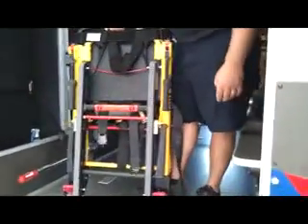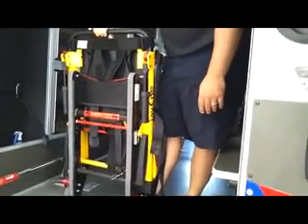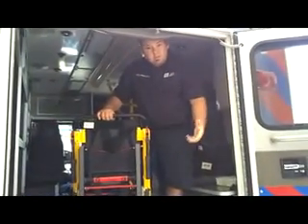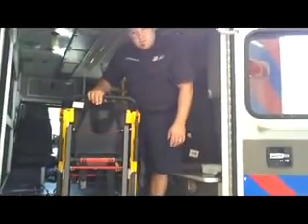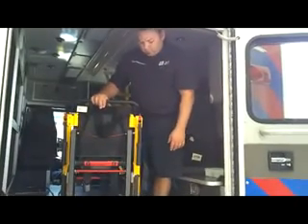This piece of equipment here is a stair chair. It basically turns into a chair if we have to take the patient downstairs. We don't have a lot of places in town with a lot of stairs, but the old school way was to grab a kitchen table chair and bring the patient down on that, and we don't know if the chair is going to work or not. It could break, and then we're going to drop the patient. This thing right here will hold, I want to say, 500 pounds, so it works a lot better. Again, it's a two-man operation, or if we have 3 people, we use 3 people.